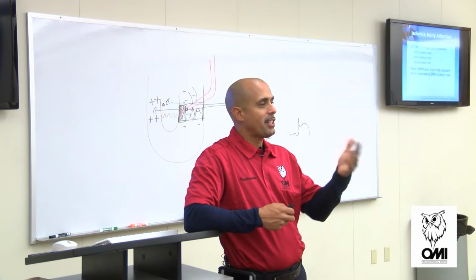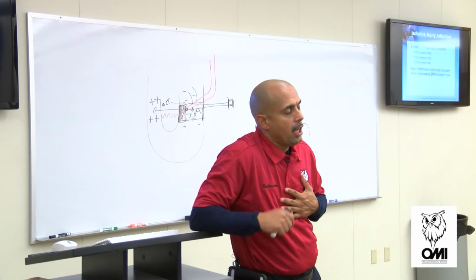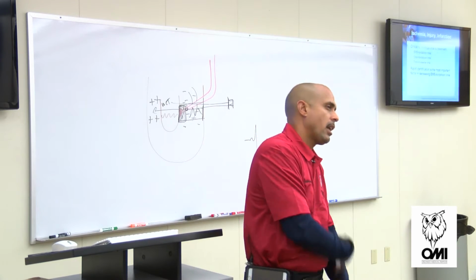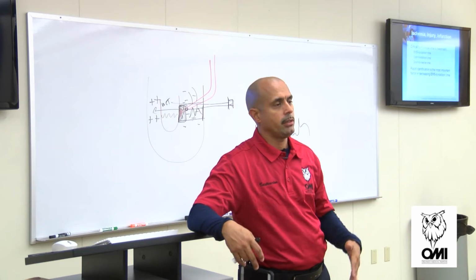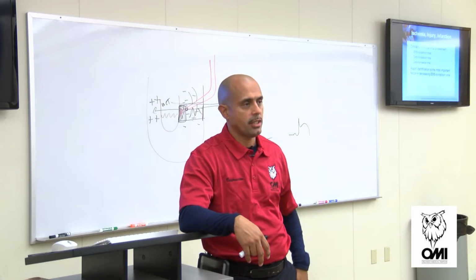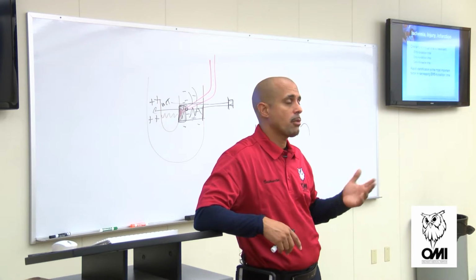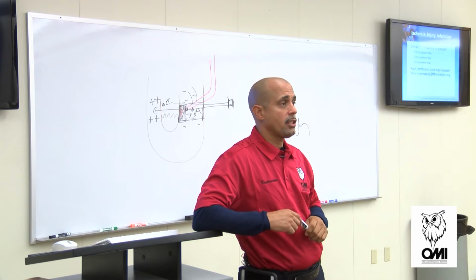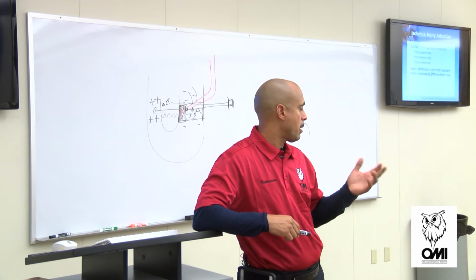So we should not be seeing a patient, oh man, cool, pale, diaphoretic, oh my chest hurts, I can't breathe, I got pain down the left arm. You do a 12 lead, says, oh, you're all right, this is indigestion, blah, blah, blah. No, you should never say that. You could treat him as an MI and take him to the appropriate facility. Because you know what that facility is going to do? Draw his blood and wait to see if his blood markers come back positive.